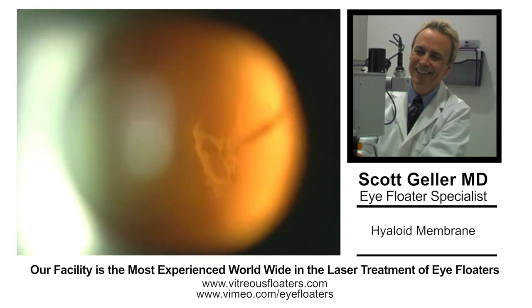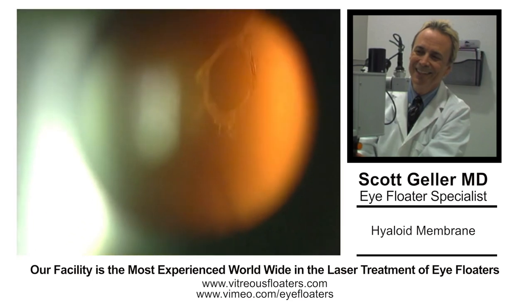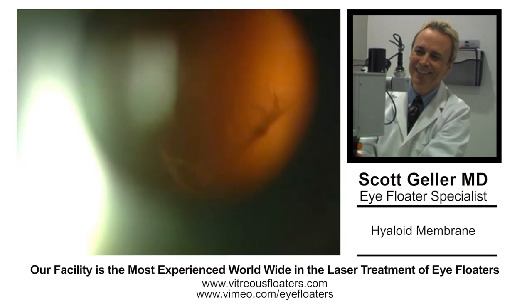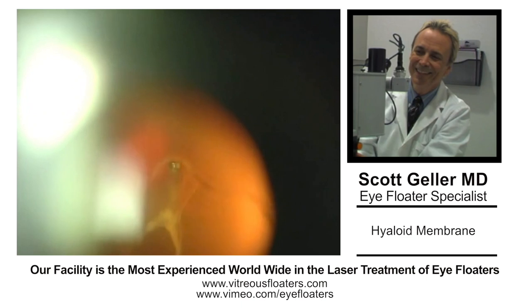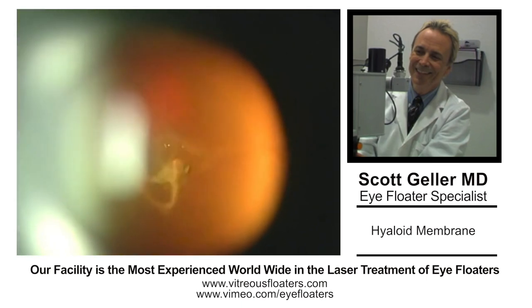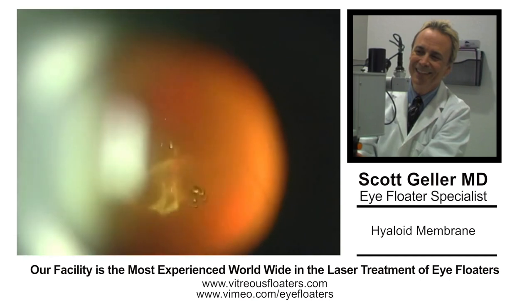If you look into the eye, we're using a CGV contact glass from Lezog and using the Lezog Microruptor laser, which is the very best on the market, made in Switzerland. There are very few of us who practice this procedure worldwide who actually have this unit, and I find it the best — I've tried them all.